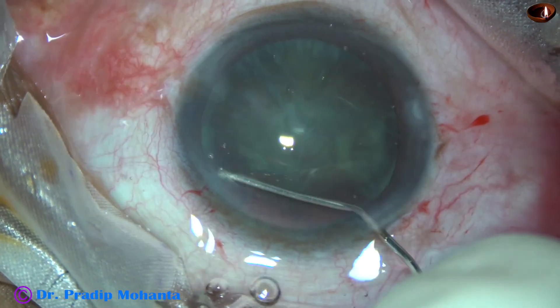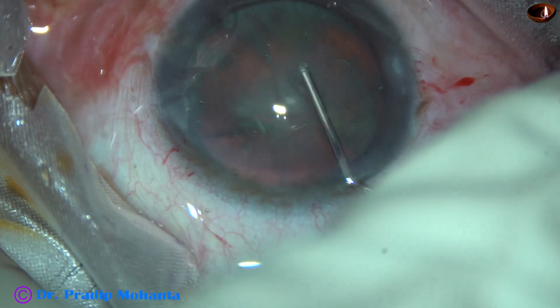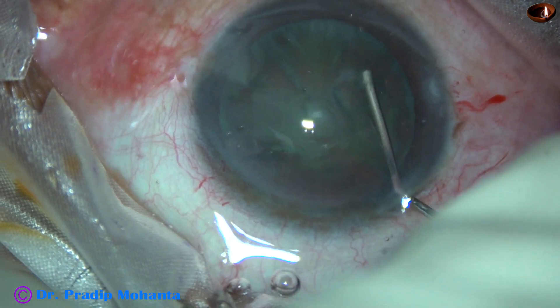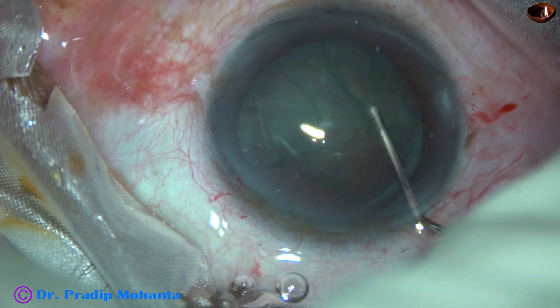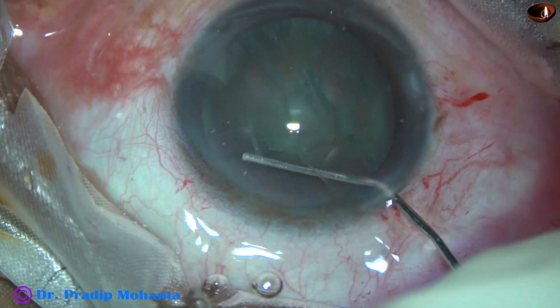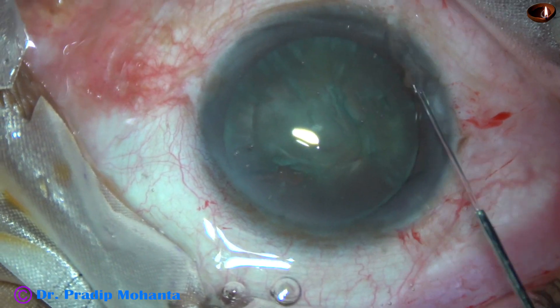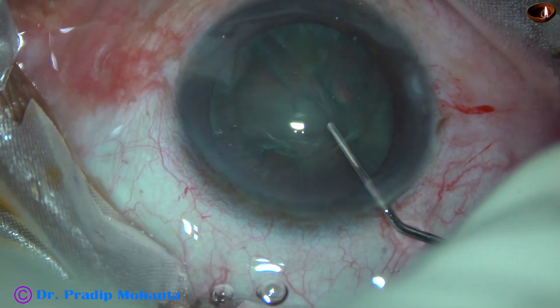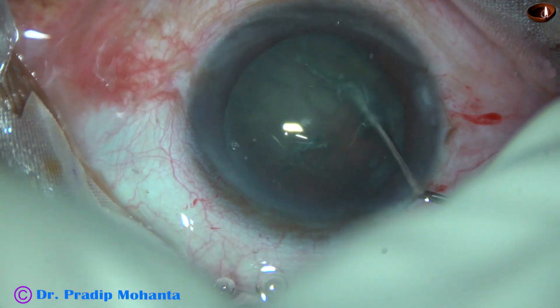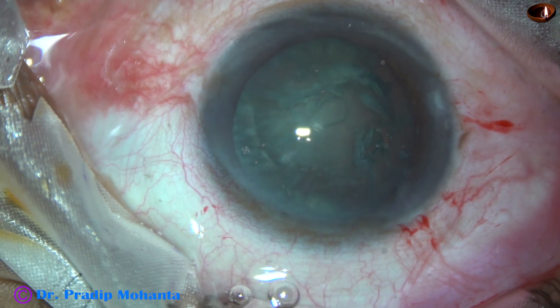Now this is hydrodissection with BSS and a 27-gauge irrigating cannula. Inject some amount of fluid; see that the fluid wave goes towards the opposite equator. Tap the nucleus — there should not be any fluid buildup behind the lens mass. Rotate the nucleus.